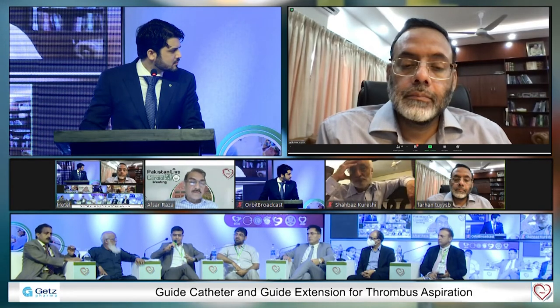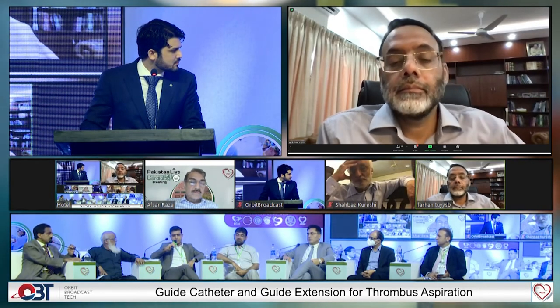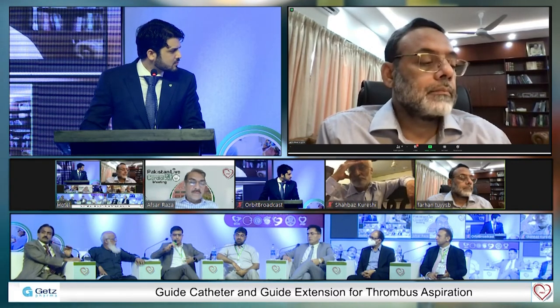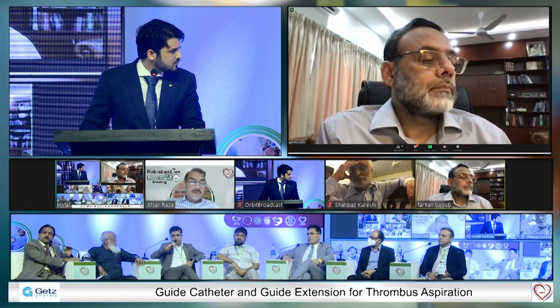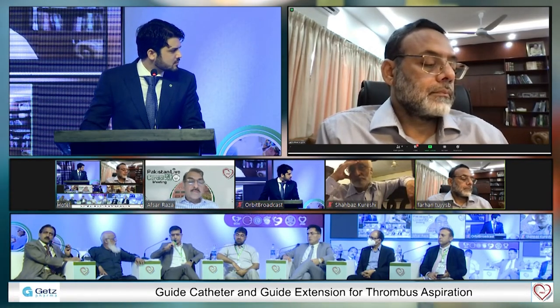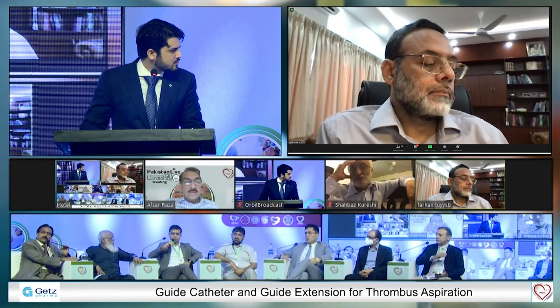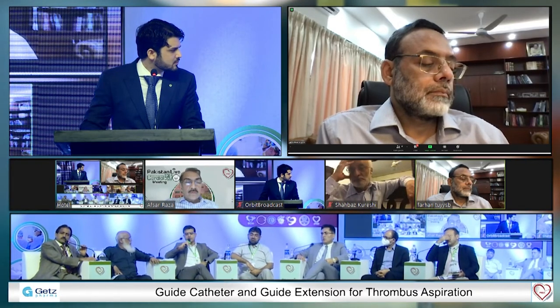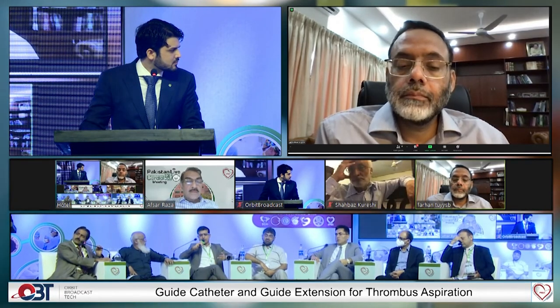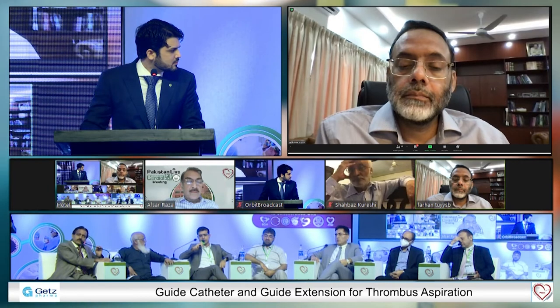And at the same time, putting these long stents, risk of thrombosis and long-term patency are again the same questions. So for acute settings, yes, you can aspirate the thrombus and leave the patient on GP2B3A and bring him back to assess for the native vessel recanalization, either antegrade or retrograde via grafts.